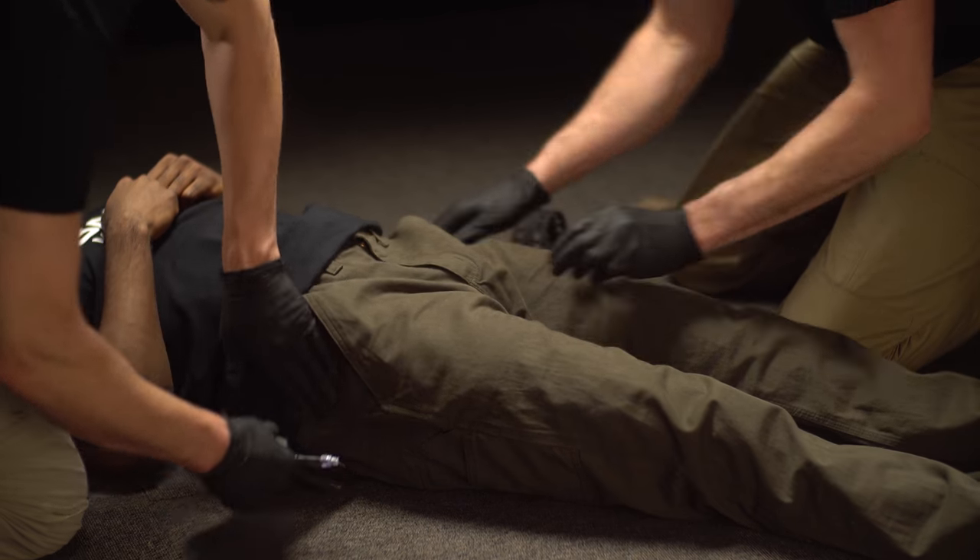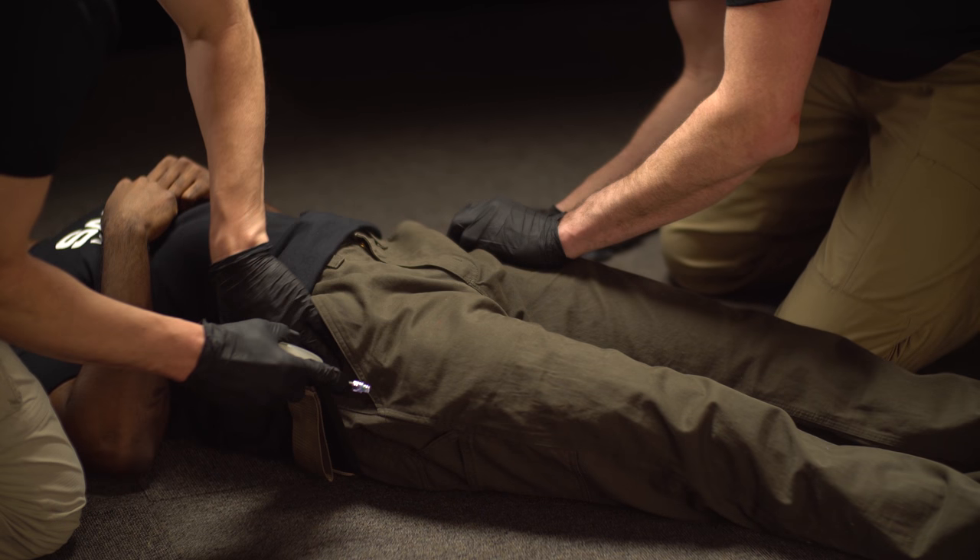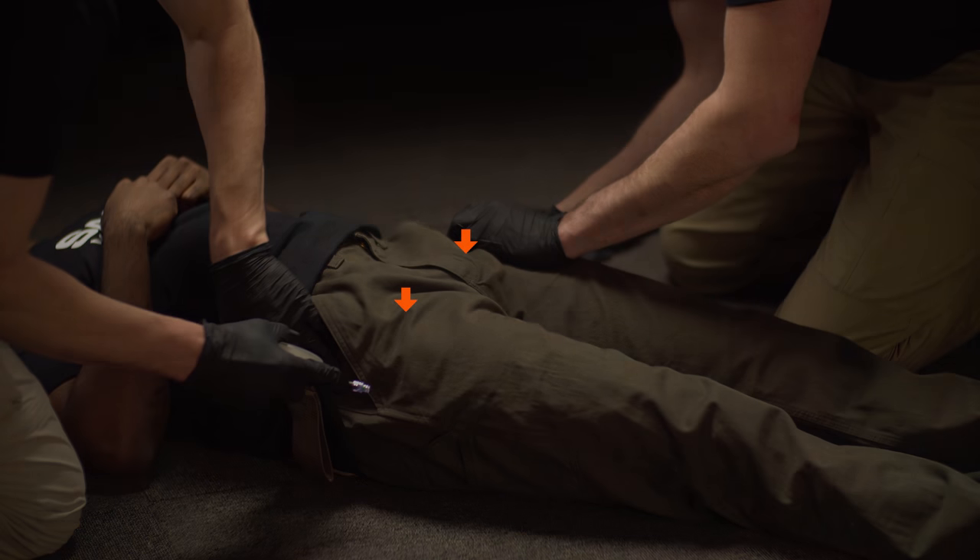Slide the belt underneath the patient, positioning the target compression device, or TCD, over the area to be compressed. If one of the TCDs is positioned directly on an open wound, first use sterile gauze or hemostatic dressing to cover the contact area.